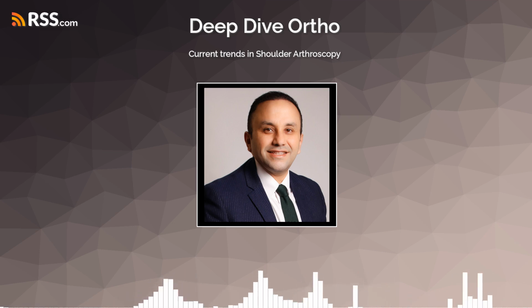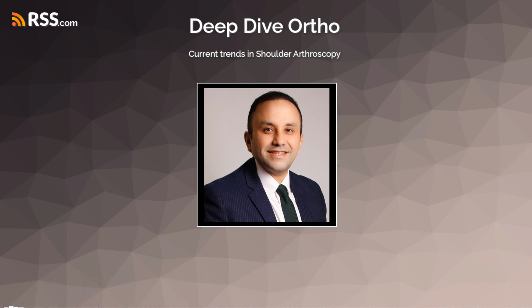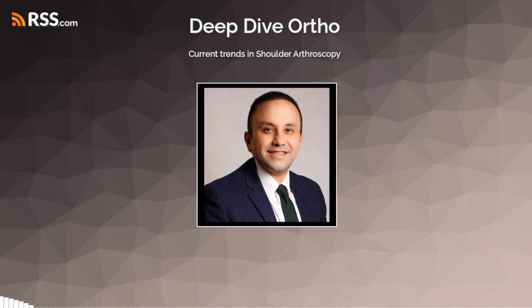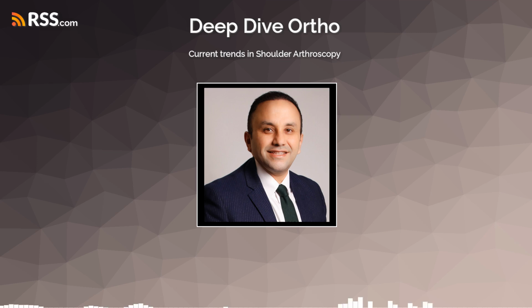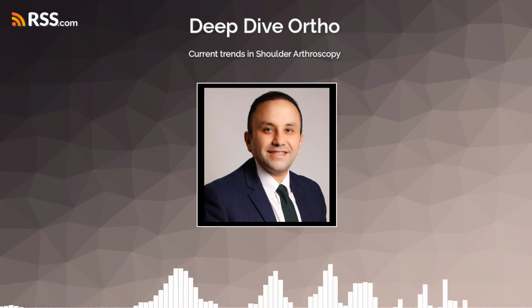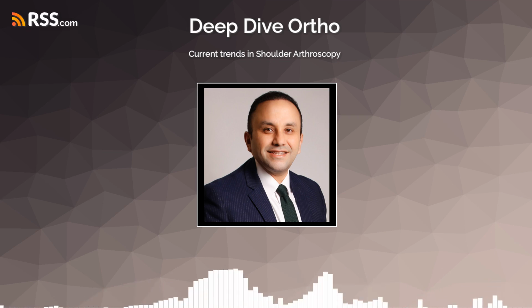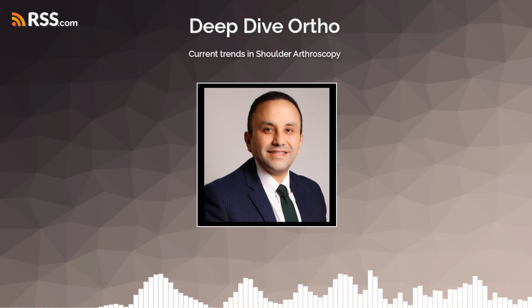These pleats are then secured with sutures or anchors. How does that compare to older open surgeries? Compared to older, open surgical procedures called capsular shifts, ACP offers advantages like smaller incisions, less scarring, often less pain after surgery, avoiding the need to detach and reattach the subscapularis tendon, and potentially a quicker return to sports. And the results? Studies have reported quite promising success rates with ACP in appropriately selected patients who have true MDI.